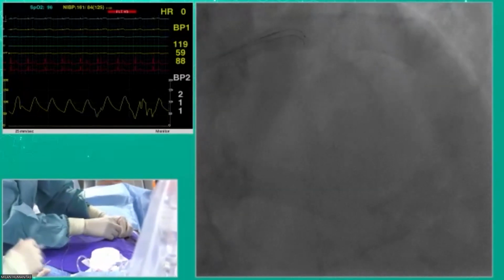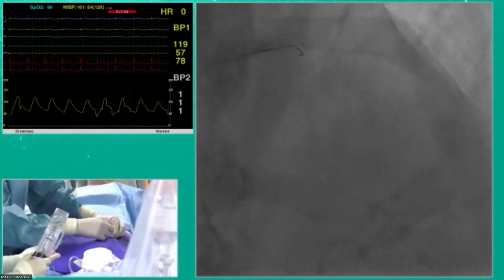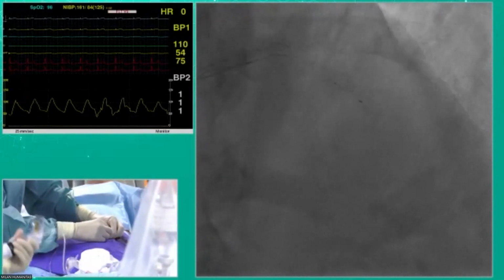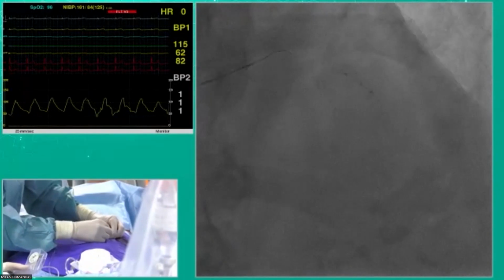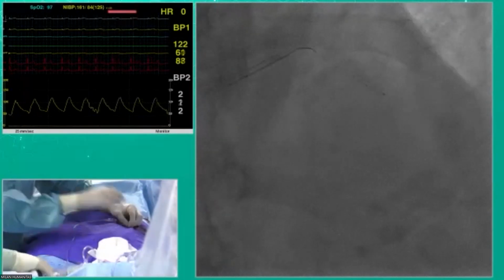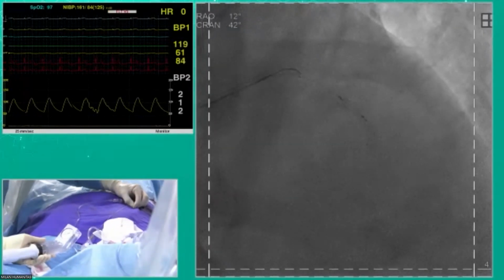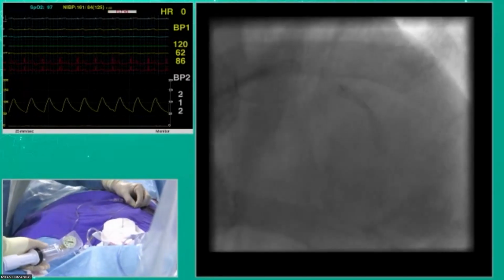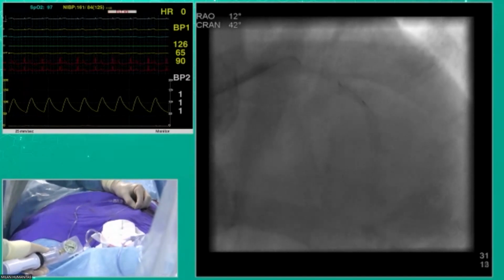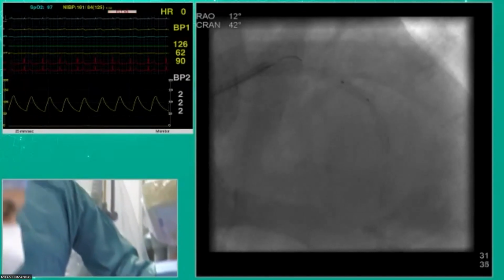And again, the teaching point of this case is not to go home and rotablate an LAD and not stent it. The idea here is to think about the distal vessel, think exactly where you're putting the stents, why you're putting them in, and optimize them as you're doing. I love the decision making, it's great. You go from one step to the next. Have a plan going in, but then keep flexibility.